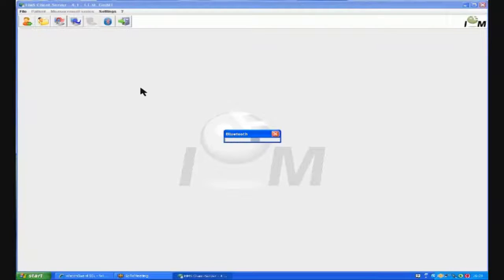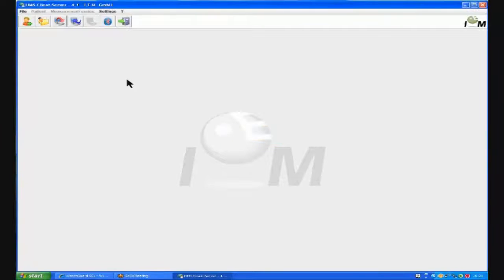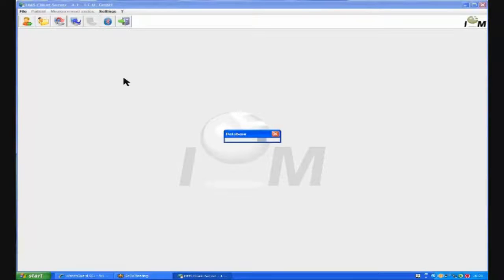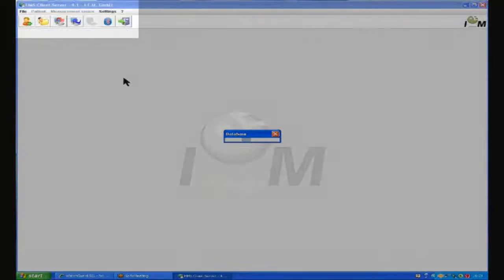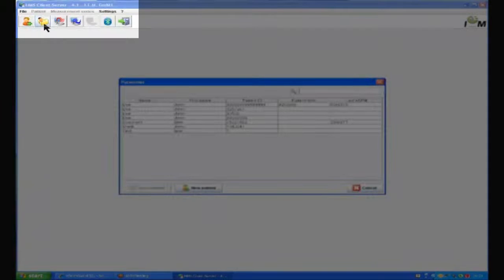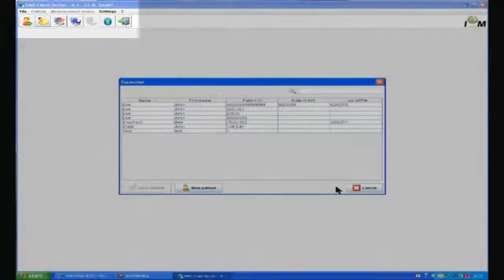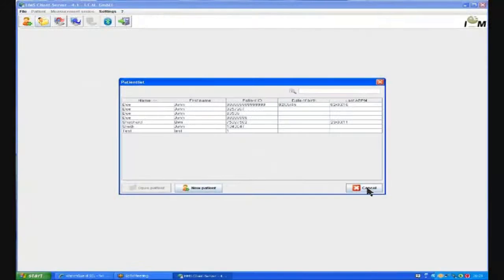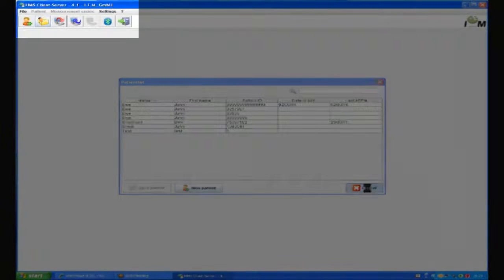The Bluetooth port sets up and the patient database is configured. If we have already performed a 24 hour blood pressure on a patient using the Mobilograph, we can click on the second icon. This will open the existing database and the appropriate patient can be selected.